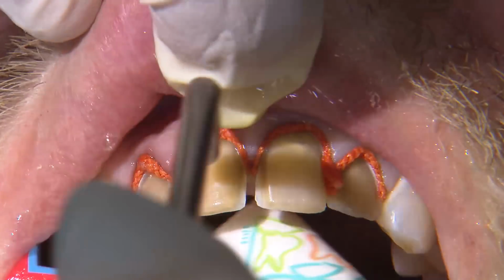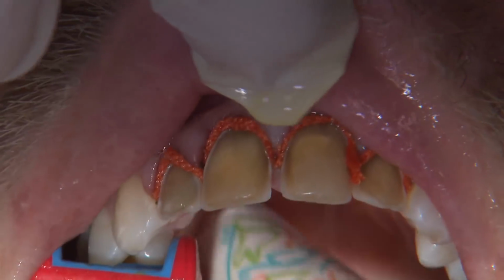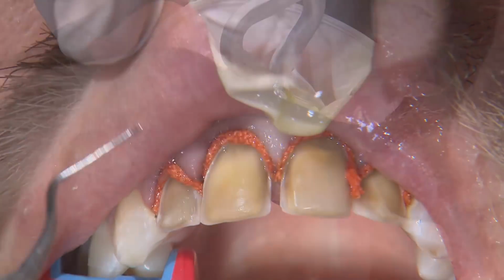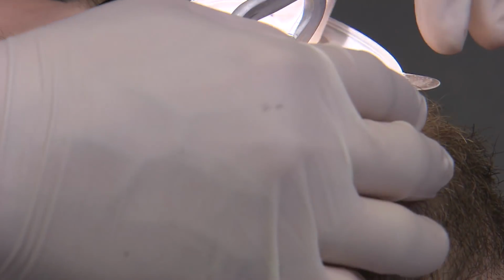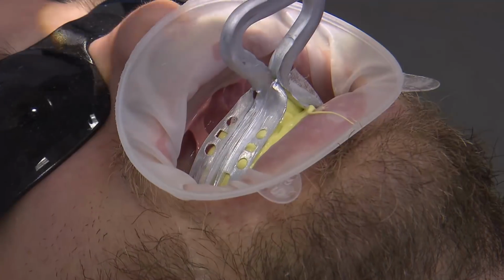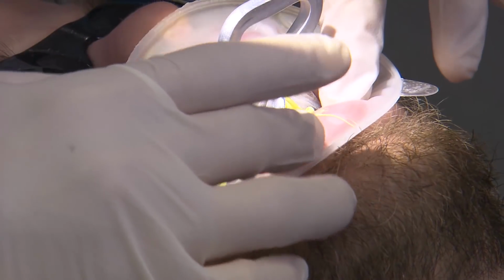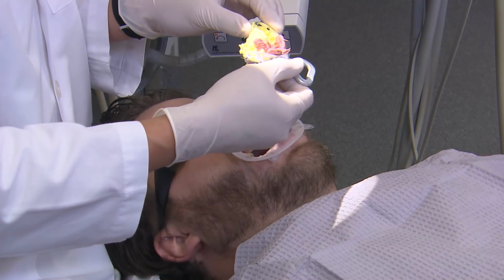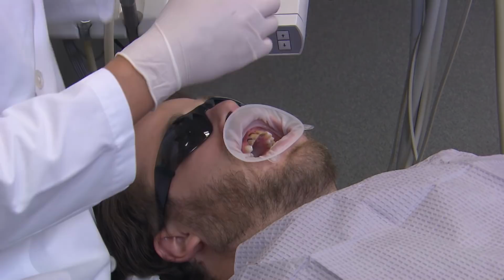I always wait at least 5 minutes for the cord to provide the desired retraction. Once the time has elapsed, I remove the larger top cord while leaving the smaller cord in place. Now we have adequate separation of the hard and soft tissue for the light body impression material to flow into. This is really important to allow lab technicians to see where the margins are located.